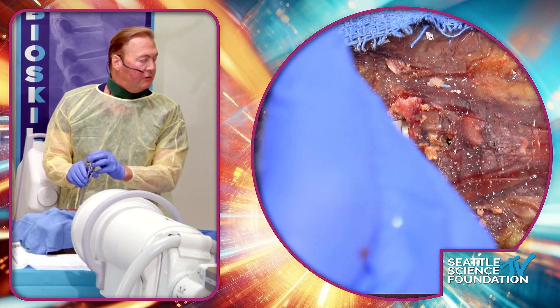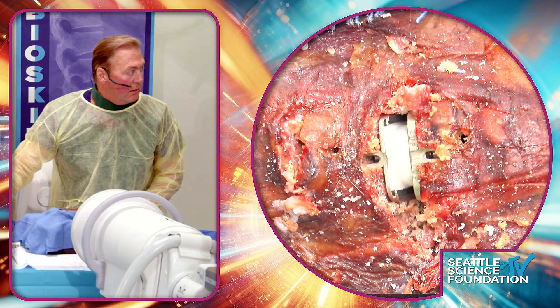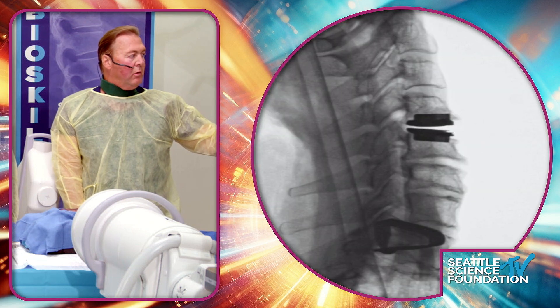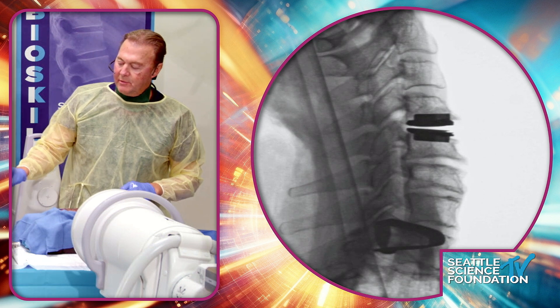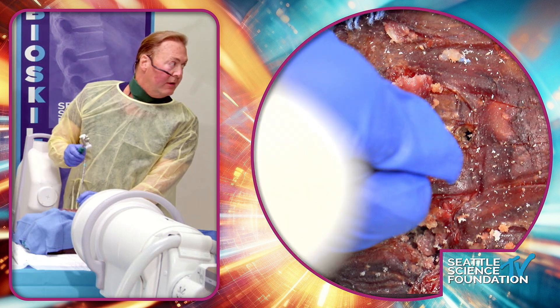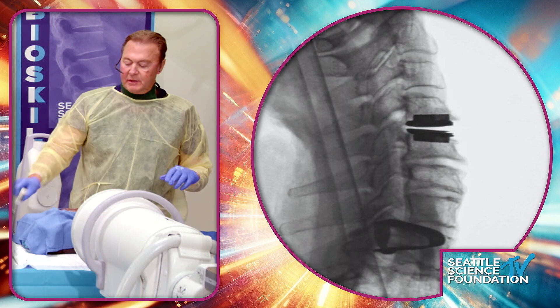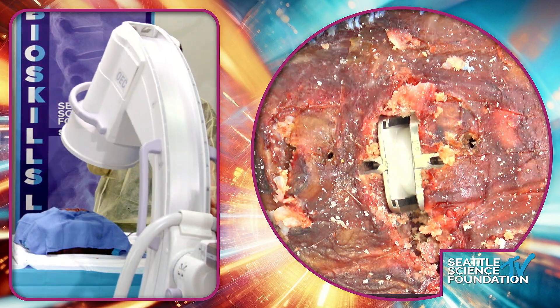Your target is the posterior intervertebral body line — that's your goal. I see this one a little further back. There's a little anterior osteophyte so you can shave that down to make it look clean, but you've got good alignment here. I could drive the upper one back slightly but I don't think it's necessary. For demonstration, using the impactor tool you can push the device back — shoot again, now you can see the upper end plate is a little better aligned.